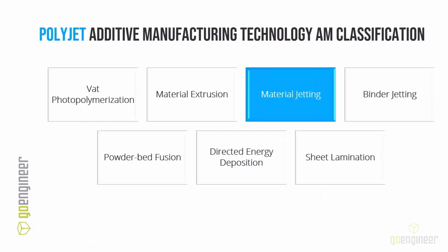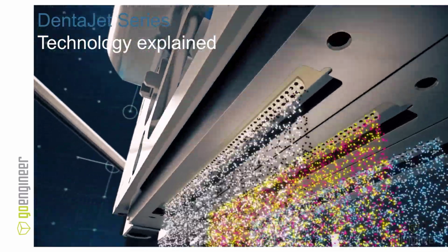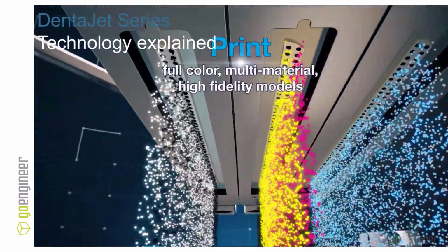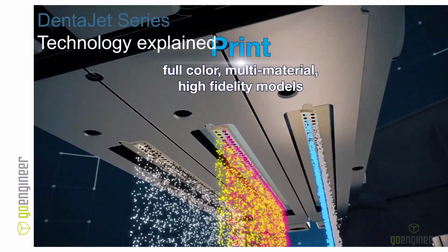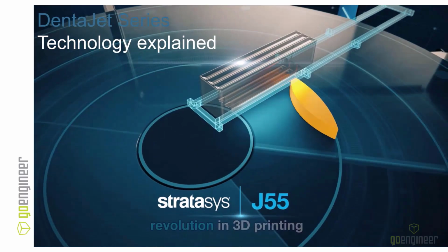the past. For those of you out there that are familiar with DLP printing and open vat photopolymerization for dental applications, PolyJet might not be a technology that you're super familiar with. If we look at the classifications for additive manufacturing from ASTM, this is a technology that is going to be categorized as material jetting. It uses a piezoelectric print head to jet microscopic droplets of UV photopolymer resin onto a build tray, and it just builds up layer by layer using these microscopic droplets.